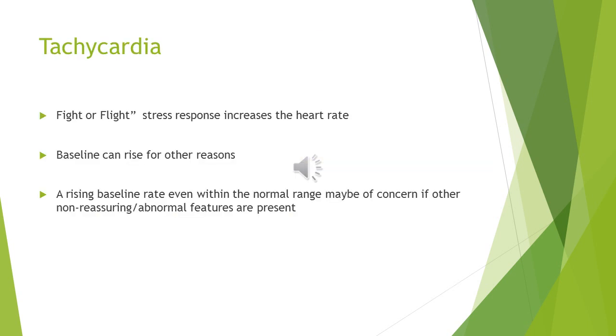Tachycardia is a fight or flight stress response. So if the baby is exposed to stress, especially infection, fetal-maternal hemorrhage, or any stress in labor, the fetal heart rate starts to rise, which we call fight or flight. However, the baseline can rise for any other reason. So a rising baseline rate, even within the normal range, may be of concern.